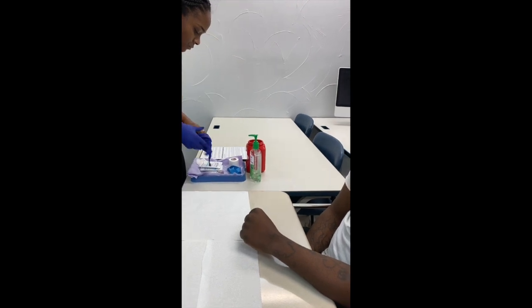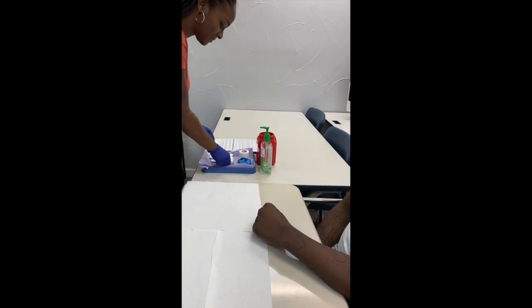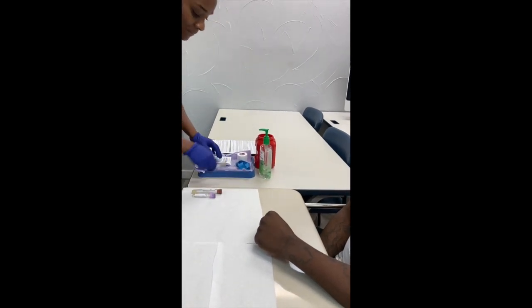How's your day been so far? Great. Right now I'm just gloving — making sure I have my gloves on. Once you get that alcohol nice and dry, it's much easier to put your gloves on. You know they're not dry if you certainly have problems putting on your gloves.